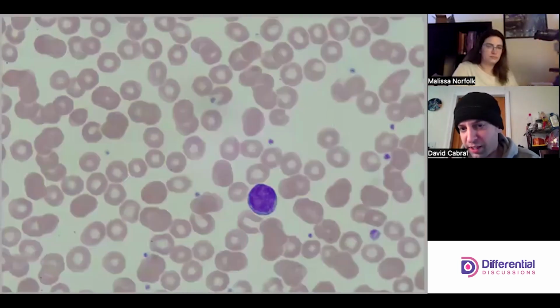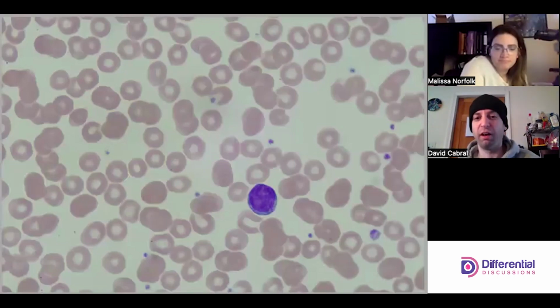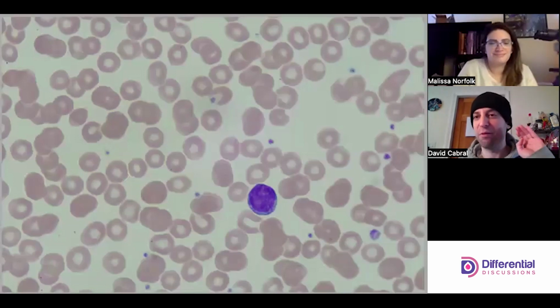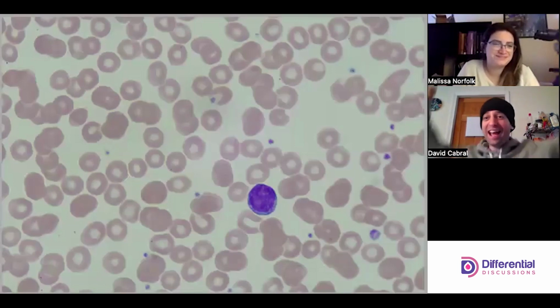Yeah, and like this lymph, little bit of basophilia in the cytoplasm, and I noticed those things, and to me, they kind of confirm that this might be a reactive process. I would not call this a reactive lymph. I want to make that clear. So I'm going to be a hypocrite and say that this is a reactive lymphocytosis without calling a single reactive lymph. But that's where I think we're at with this particular patient. Yes, indeed. You're right. Yay!